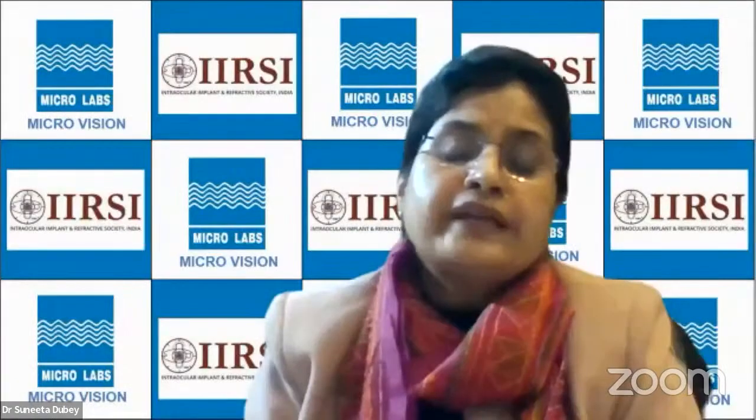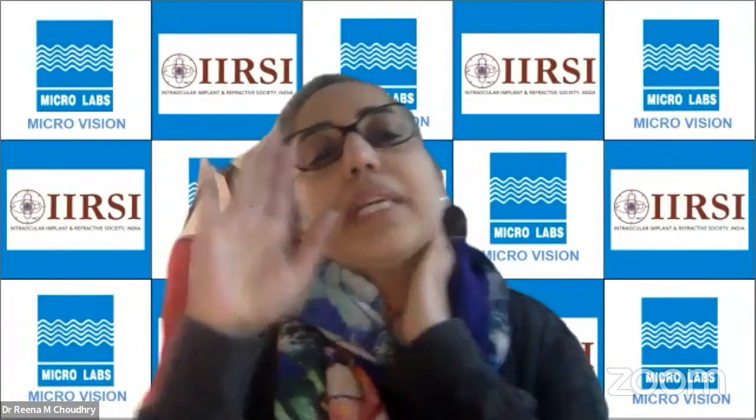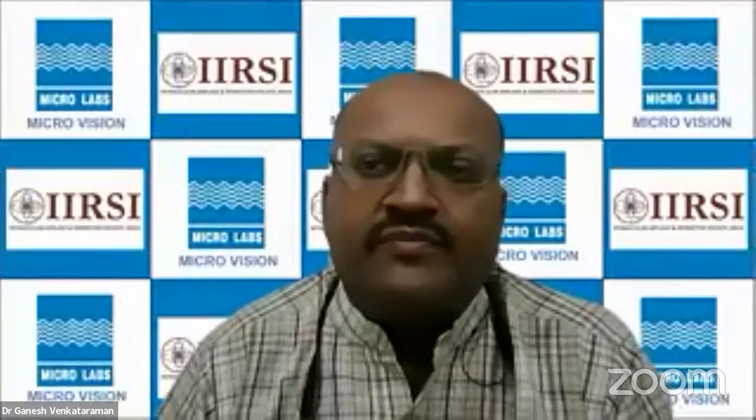So you do needling with 5FU or mitomycin C? I would do it with mitomycin C. Can you tell us, Dr. Ganesh, the technique? How do you do needling with mitomycin C? The important thing is to find out whether the ostium is patent or not. That's something you have to do gonioscopy for. If the ostium is patent, what you see is the light going in but not coming out. It's something like a small cyclodialysis cleft. You see a gap between the flap and the base of the flap. So now you know that the episcleral tissue is what you have to address. If the flap is totally adherent, that means you have to address the ostium also.